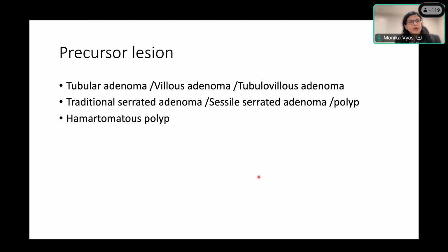So next we come to the precursor lesion. So a lot of times with gastrointestinal carcinomas, the carcinoma will completely overgrow the precursor lesion, and we can't identify whether this was arising in a tubular adenoma, tubulovillous adenoma, or a serrated polyp. But sometimes you can identify, and when you can, it's good to note what type of tumor it's arising in.